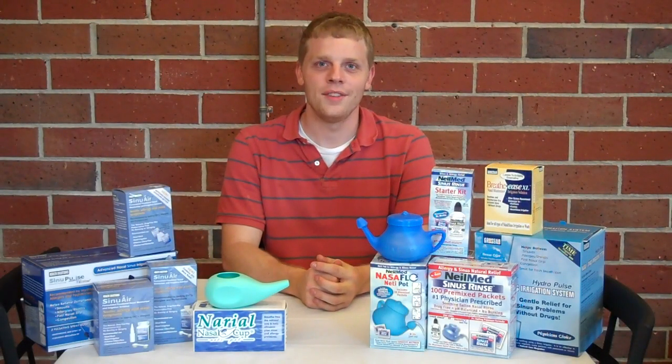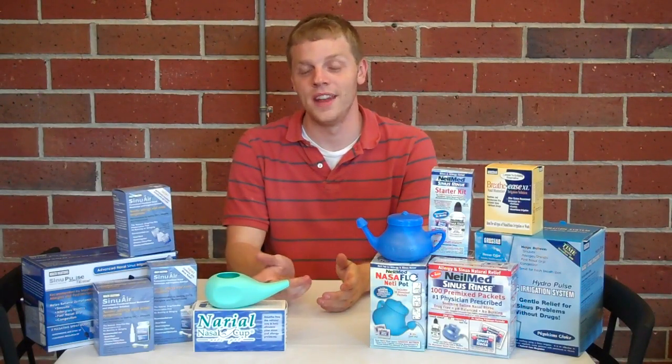Today we are going to be taking a look at two of our nasal irrigation products: the Nasal Flow Neti Pot and the Nerial Nasal Cup.